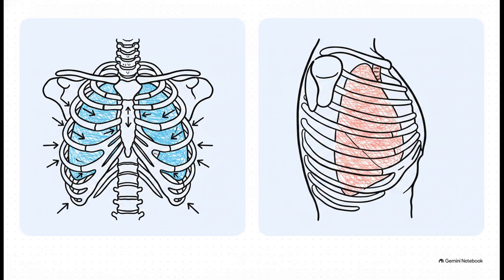If you're seeing rib retractions or an X-ray showing only 5 or 6 spaces, those lungs are collapsing. You need a bit more PEEP to stent them open. But if the chest looks totally hyperinflated and barrel-like, you've gone too far and you need to back it down.